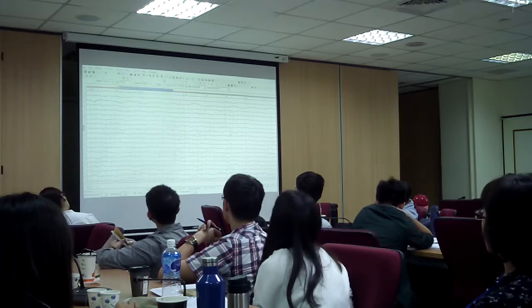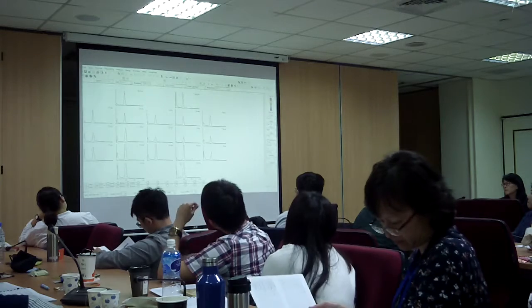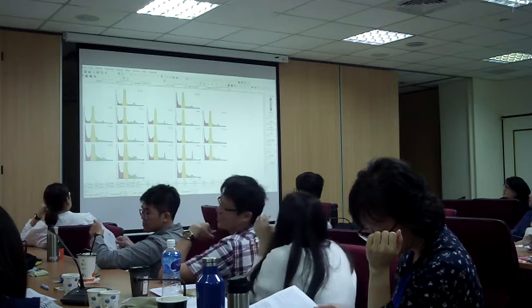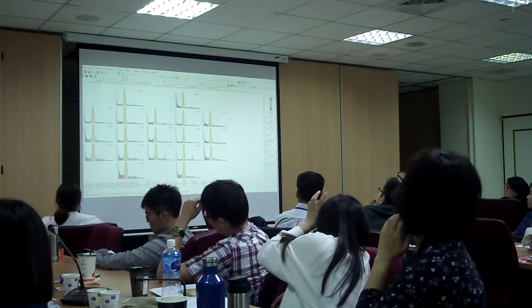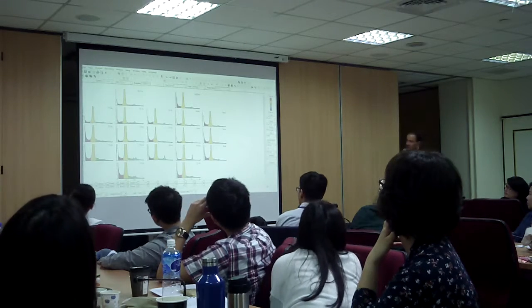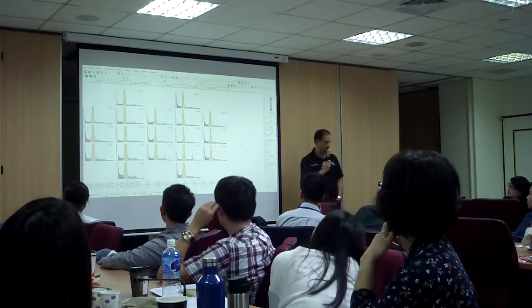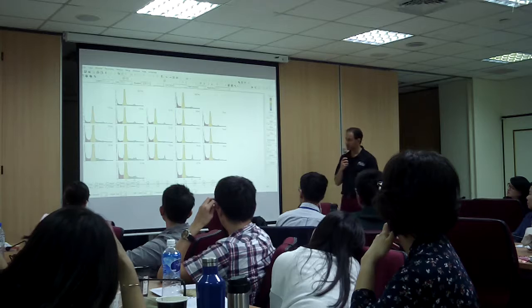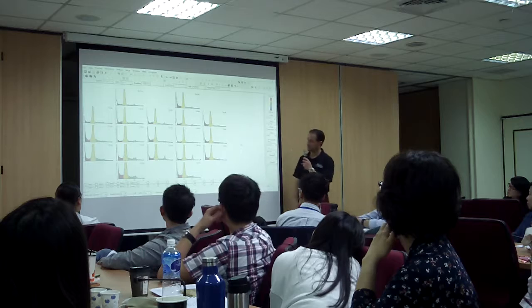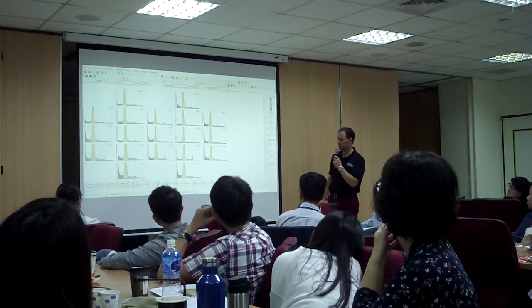So, analysis, EEG spectrum, and there we go. Look at that. So what's the most salient feature? What's the yellow one? Alpha. A lot of alpha slowing, eh? Interesting. And we have some high beta. That could be EMG, but it's also a little bit of high beta.